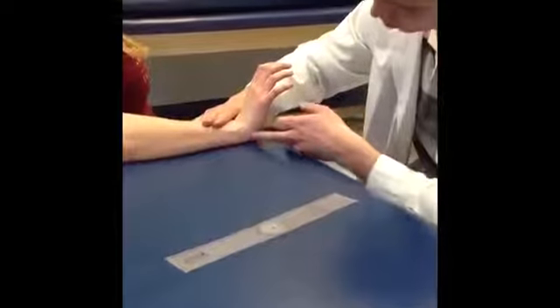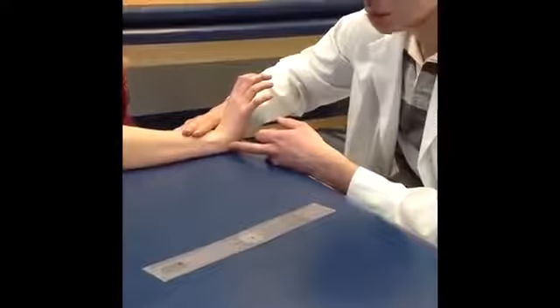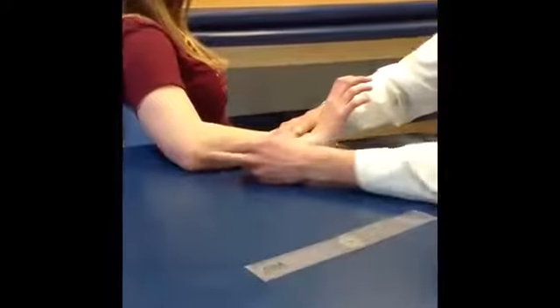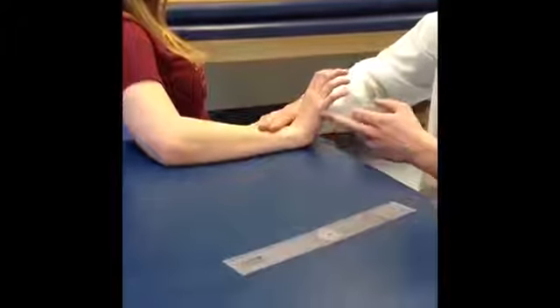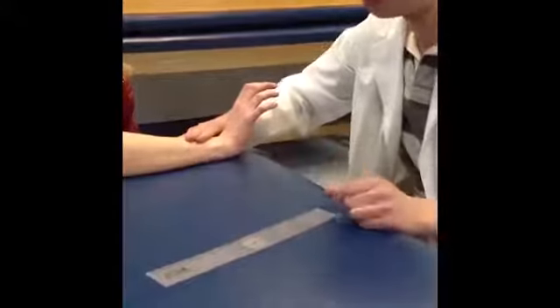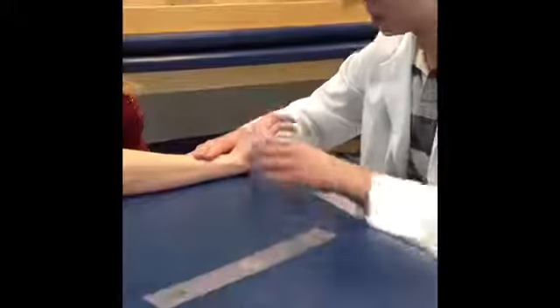Perfect. You just want to look at, so our fulcrum, to review from the slideshow, is going to be the triquetrum. Then you're going to have the shaft of the ulna up to the olecranon process, and the shaft of the 5th metacarpal for the movable arm. The stationary arm is the olecranon. So then you're going to visually confirm, okay, it's about 70 degrees, I'd say, give or take. And then ask her to relax.